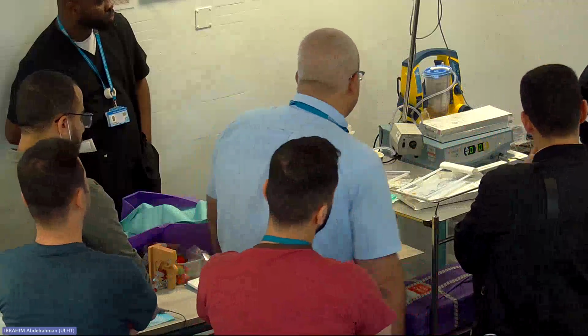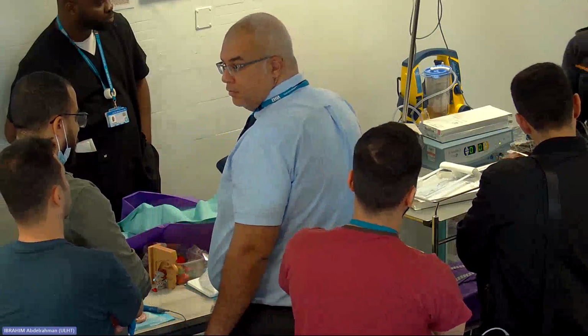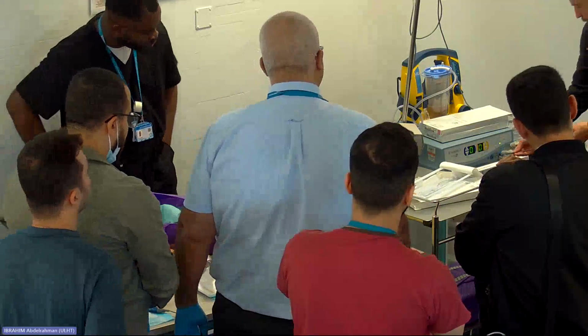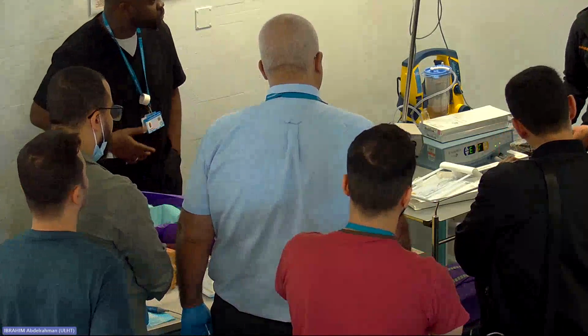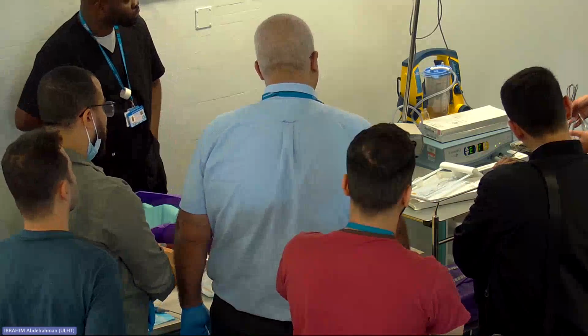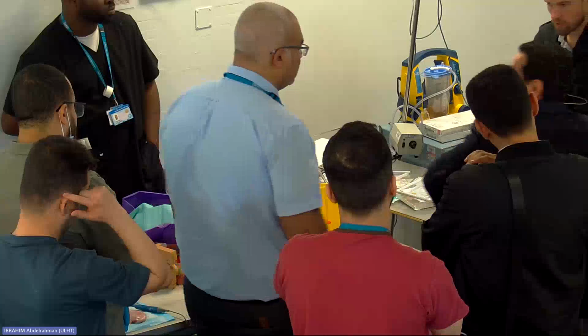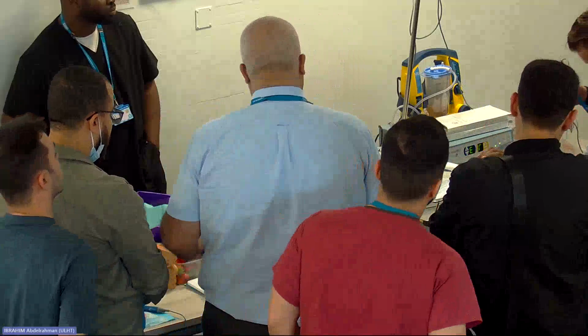First, suction, the electrical component, and the irrigation. The electrical component, the dark grey wire, plugs into the only hole. You can choose the option of intracapsular, as we spoke about earlier. So if you want to start intracapsular, then you have got your suction.